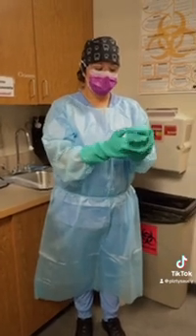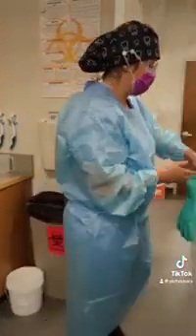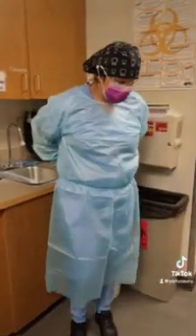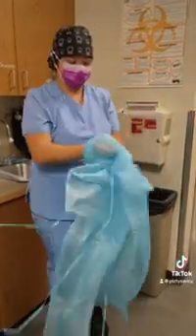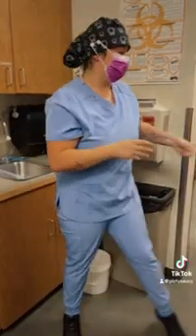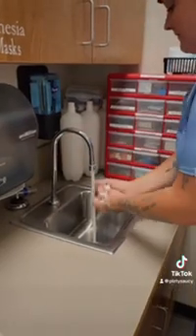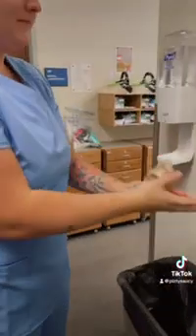After our utility gloves have been sanitized, we are going to begin to remove our PPE. After our PPE has been removed, we are now going to wash our hands with soap and water and disinfect with hand sanitizer.